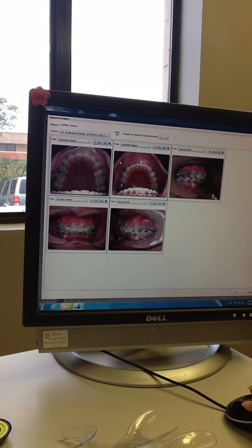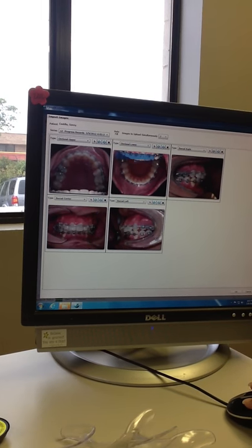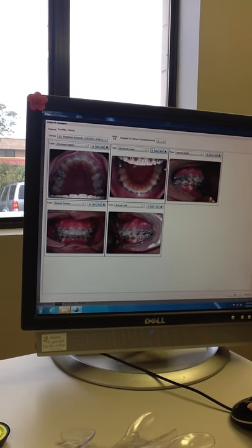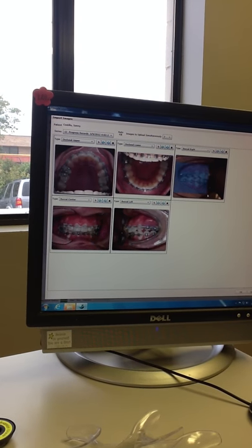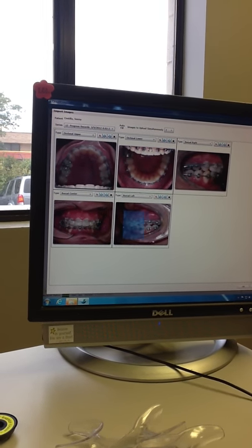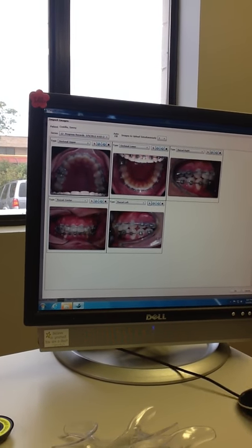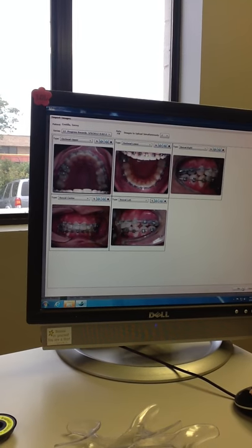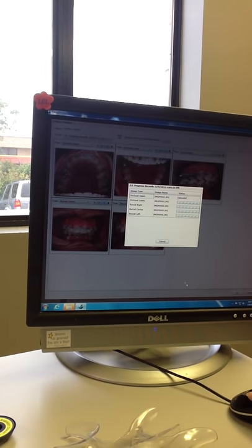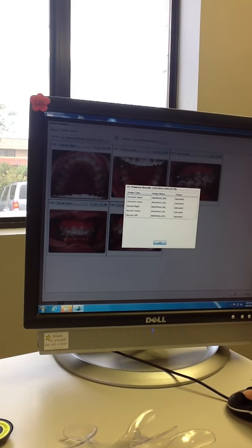She's going through the bracket. Notice how she's cropping it to where you can see all of the teeth and not much of the cheek. After they're all loaded, you can proceed.